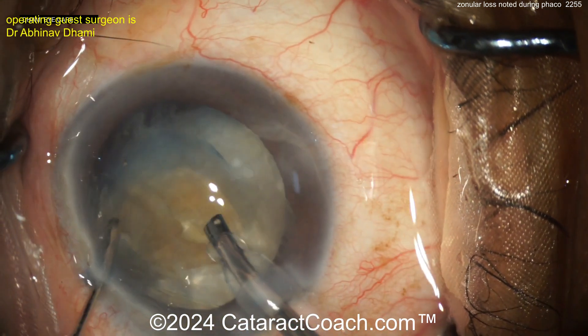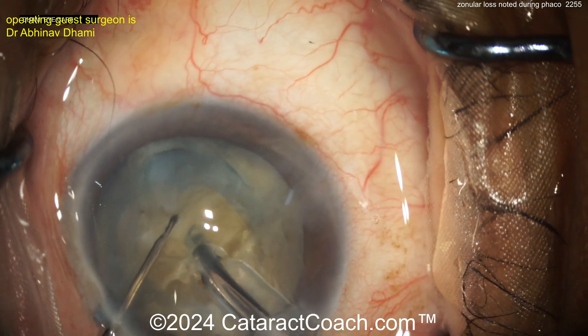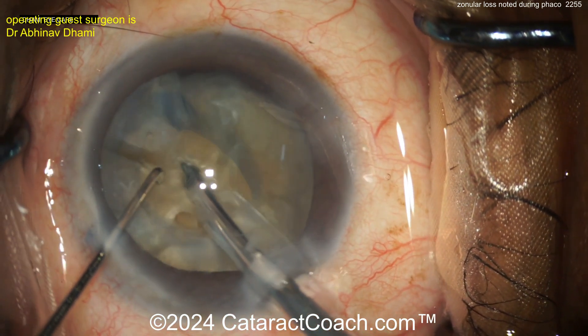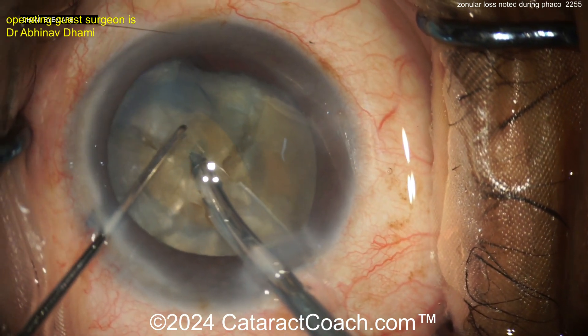Watch the rhexis edge as you do this — look at the rhexis edge moving so much. And as you take pieces out of the capsular bag, now the bag can collapse. You get these pieces out of the capsular bag and you're going to notice — look where the rhexis is now. It's really moved a lot.